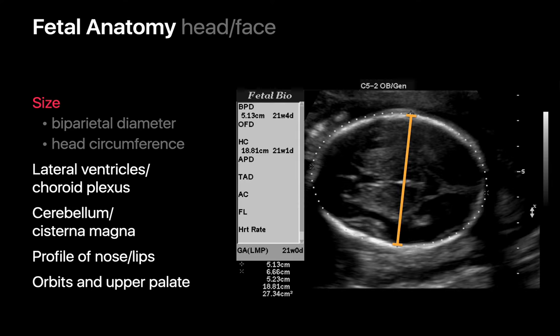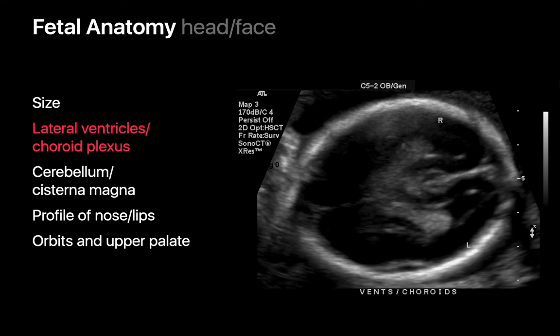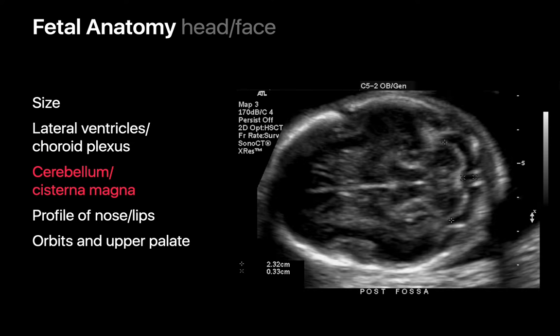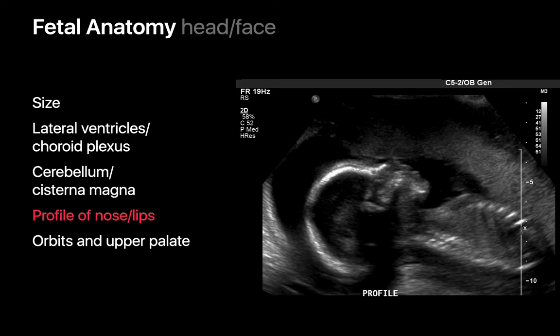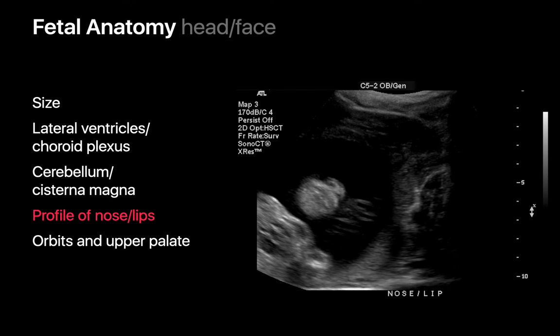The assessment of fetal anatomy begins with the fetal head and face. We evaluate the size of the fetal head by measuring its biparietal diameter and circumference. We evaluate the lateral ventricles of the fetal brain and choroid plexus, the cerebellum and cisterna magna, measuring the width of the cerebellum. We estimate the size of the cisterna magna by measuring from the posterior margin of the cerebellar vermis to the inferior surface of the occipital bone — distances over 10 millimeters are usually abnormal. We evaluate the fetal chin, lips, and nose to rule out clefts; 3D ultrasound can be useful here.